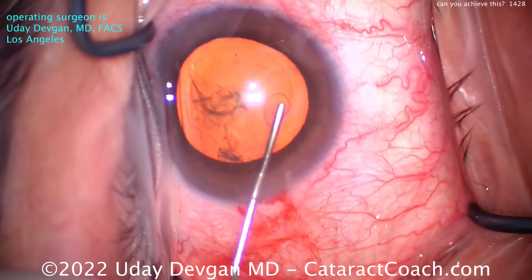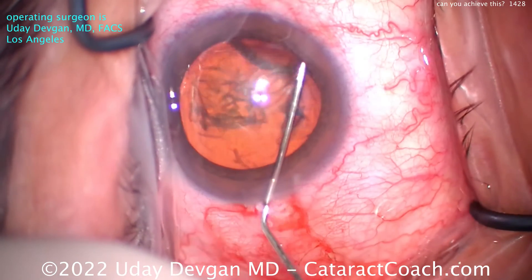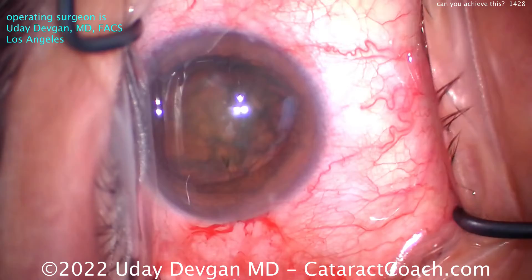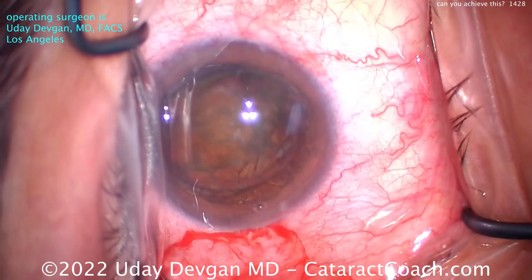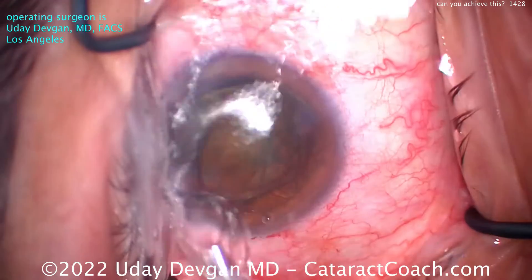Other steps like hydrodissection or even the nucleus removal can be even more efficient. My goal is not necessarily just pure efficiency, but it's a safe surgery, a reproducible surgery, a pretty surgery. Little touches like that extra aliquot of viscoelastic to protect the central corneal endothelium — that's important.